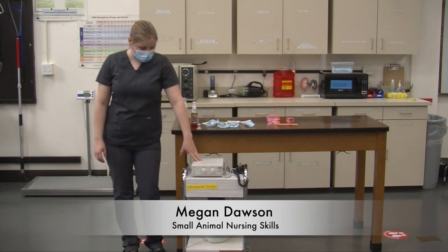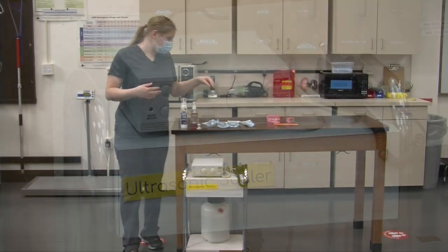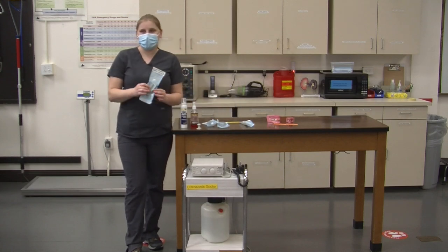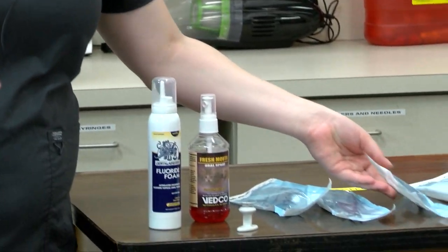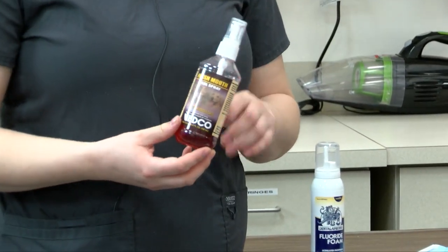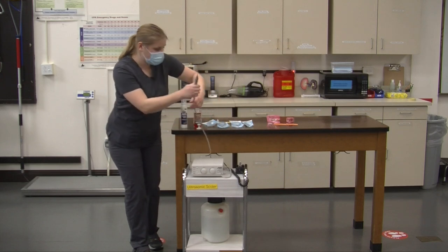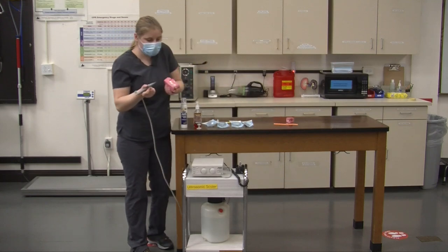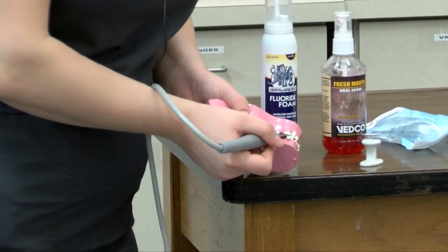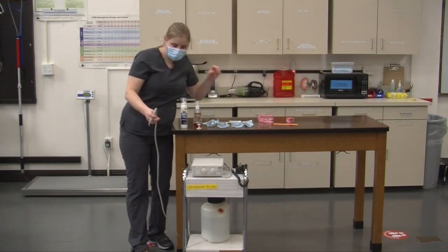I'm now going to show you how we perform a dental on our patients. This is our ultrasonic scaler — it's what we use to clean and polish the patient's teeth. The first step once your patient is prepped and ready is to take our calculus removal forceps, which are used to break large chunks of calculus off the patient's teeth. Then we would spray the patient's mouth with Novosin spray and let it sit to help with the bacteria in the mouth. Next we take our ultrasonic scaler, which vibrates to clean tartar off the teeth. You'd use a couple of strokes downwards — you don't want to leave it on the tooth too long because it could overheat the tooth and cause damage.